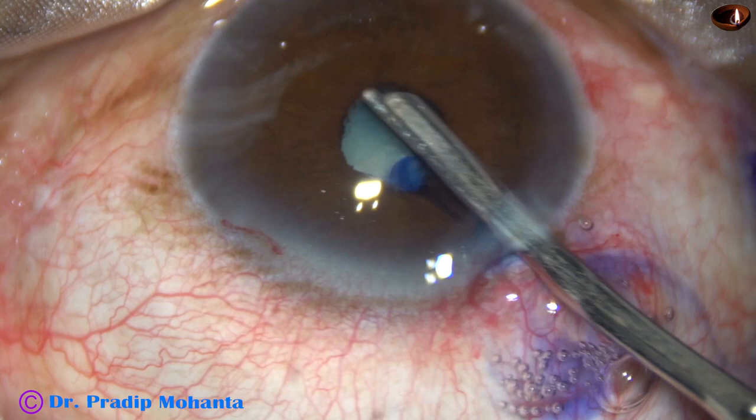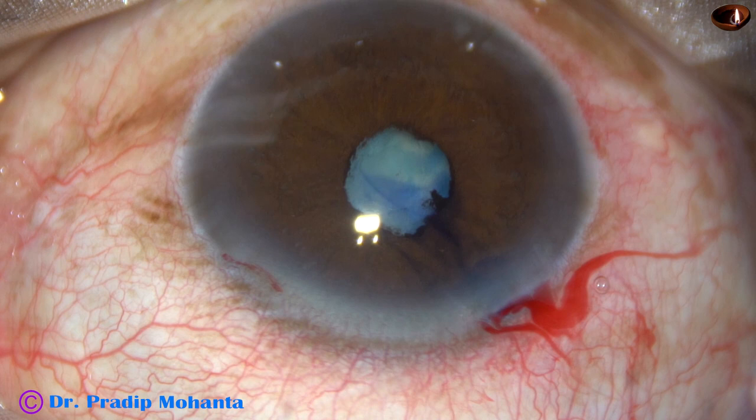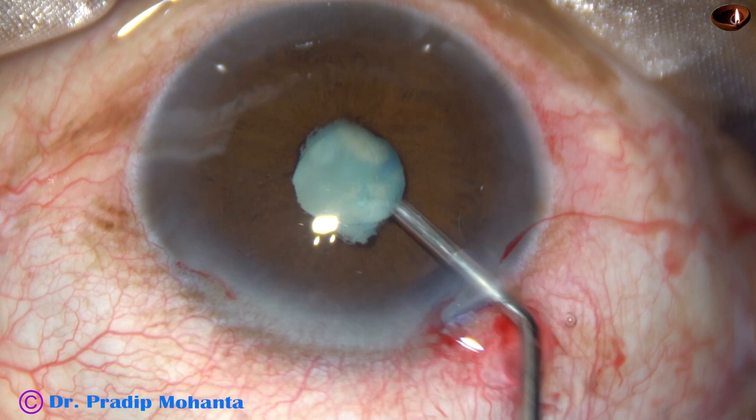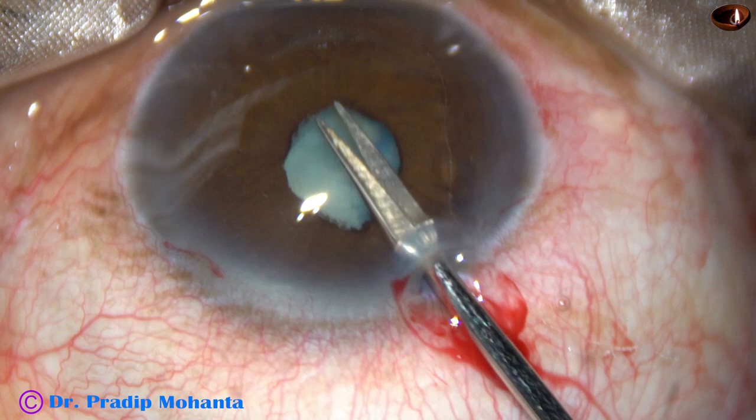Hydroxypropyl methylcellulose is injected again. Now I am going to use a pupil expansion device. But before that, I am going to cut the fibrous band by doing micro sphincterotomies at 2 or 3 places.